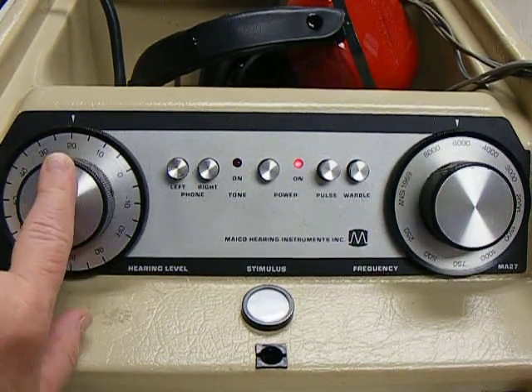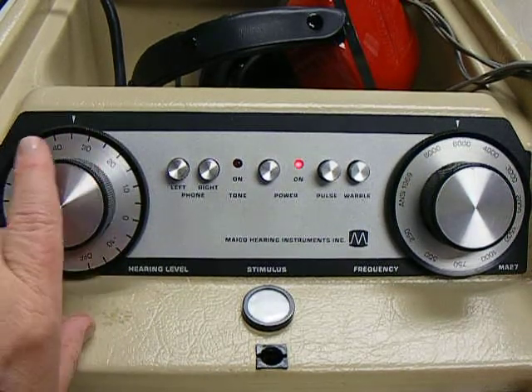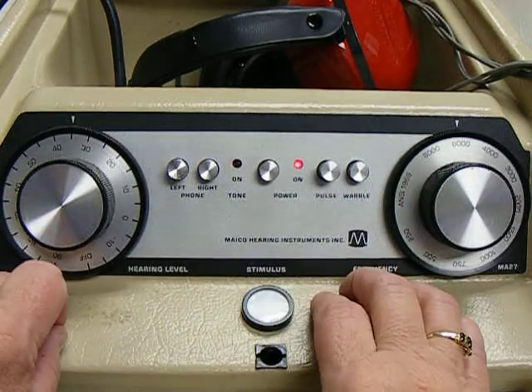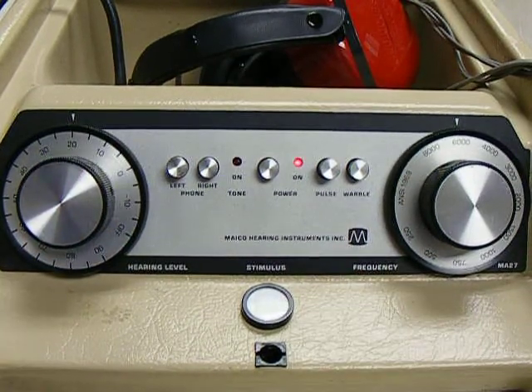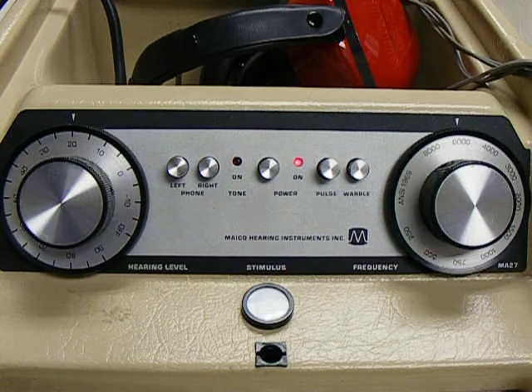If a student does not hear the tones at 20 dB, you may go up to 30 or 35 and give them a presentation so that they know what they're listening for, but they do need to pass at 20 dB. If a student doesn't pass the test at all frequencies at 20 dB, please contact your audiologist. Thank you so much.